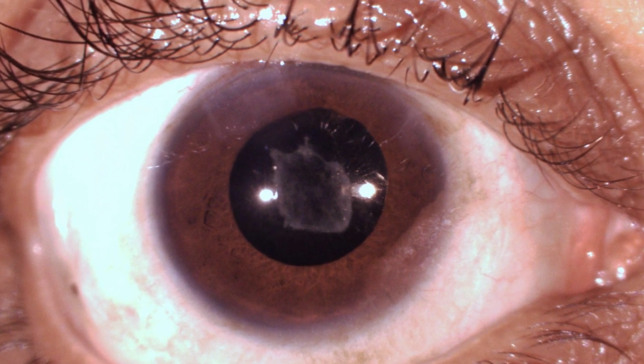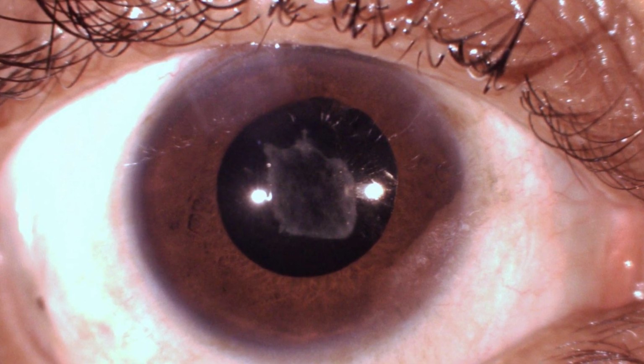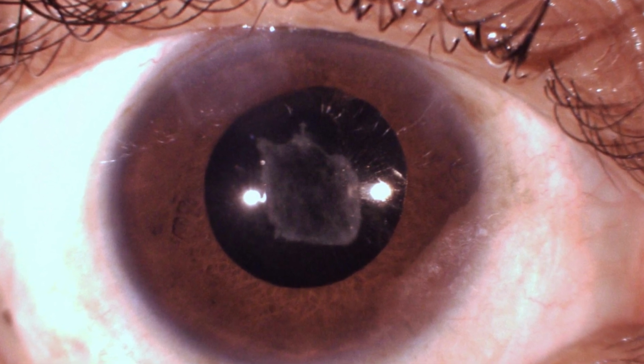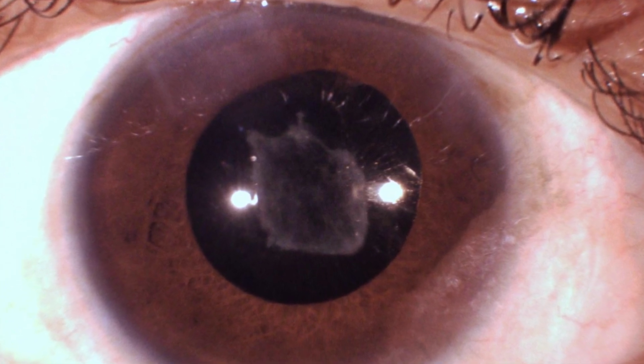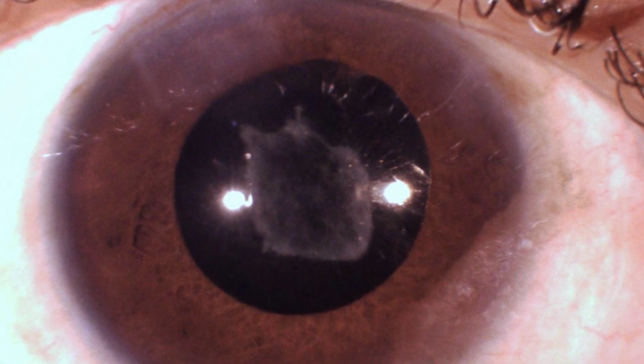There is a plaque on the posterior capsule which is causing hazy media and poor vision. This patient was 6/60 with some amount of correction as expected, and the patient has been assured about improvement in vision once we do a YAG laser capsulotomy about 4 to 6 weeks after this surgery.